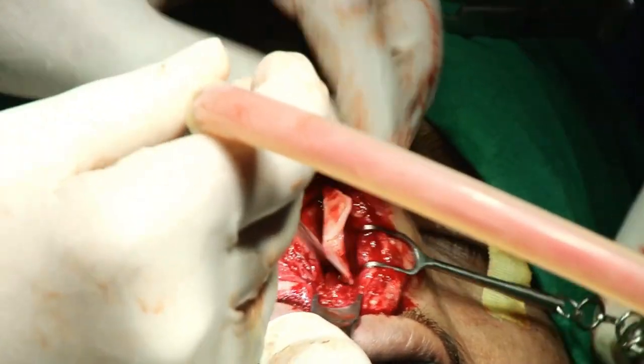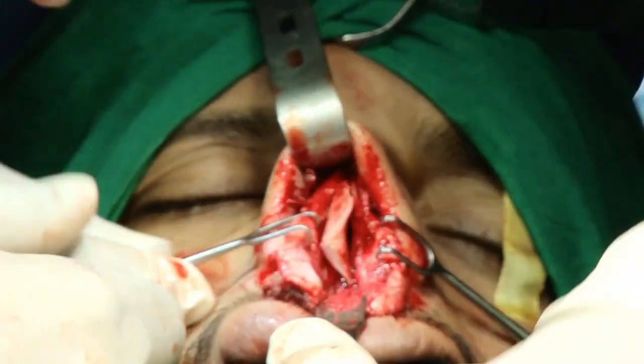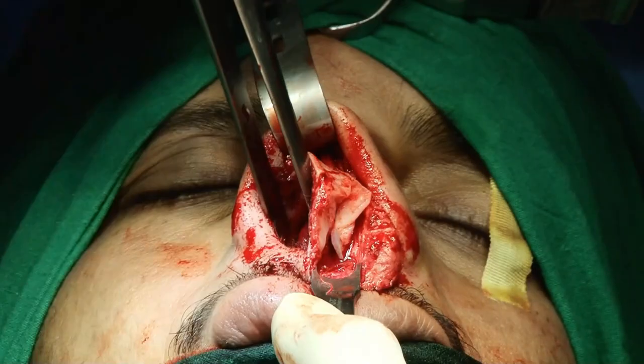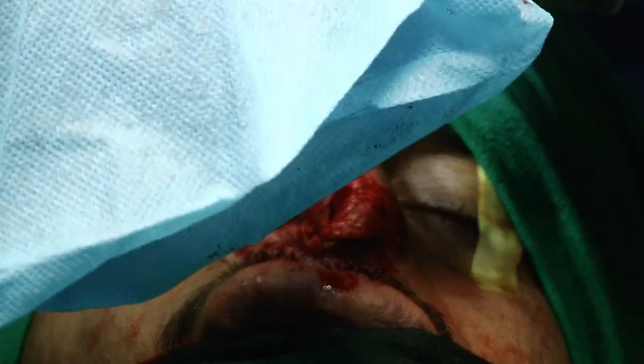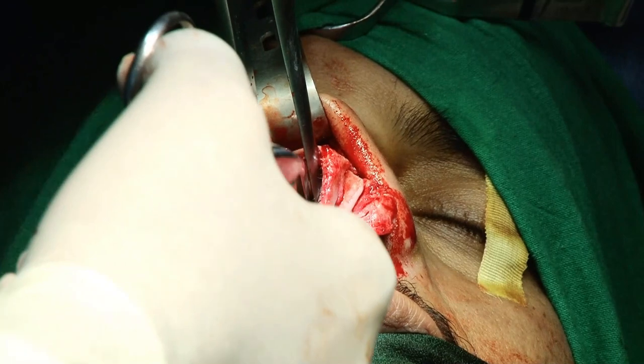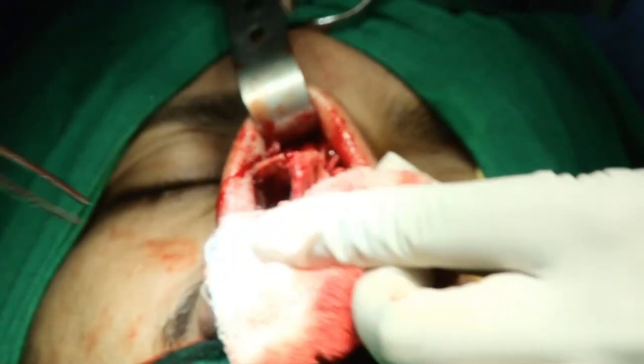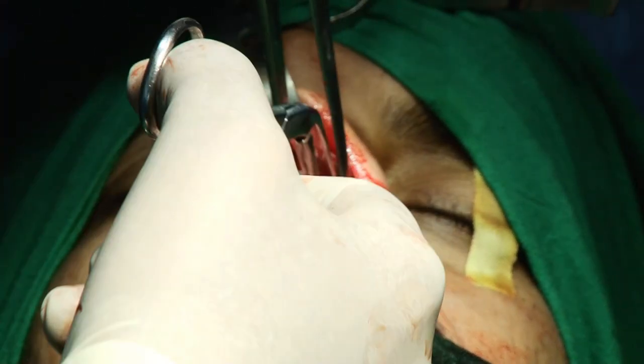So first, now I check both sides of the nasal cavity. Is there any deviation or septal spur? Checking for that. Because earlier on this side the septum is deviated, but now on this side we have good enough space. Now on this side also.